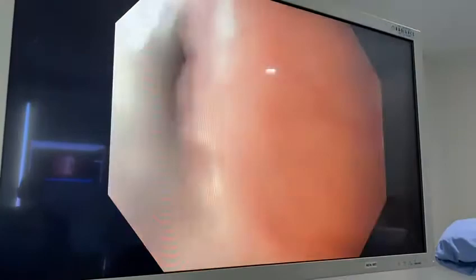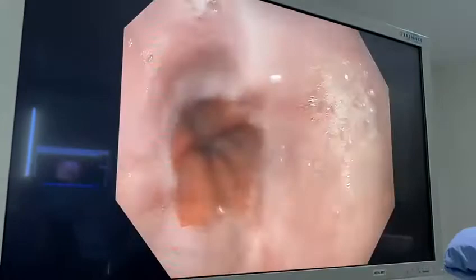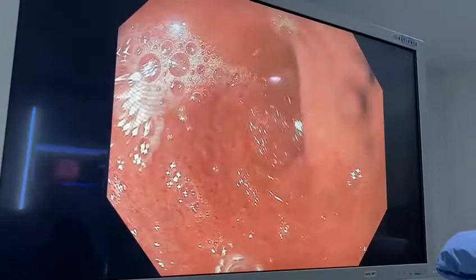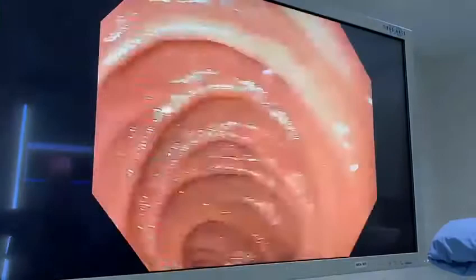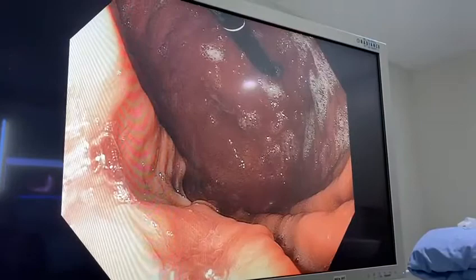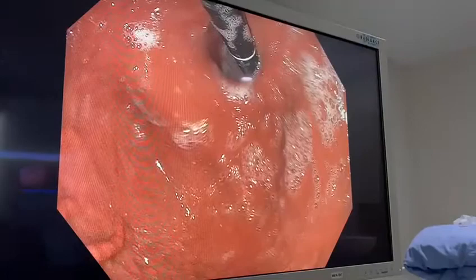First we inspect the stomach to make sure that there are no surprises there. I'm in the stomach now, I'm going to do a quick inspection. This is the first portion of the small intestine, the duodenum. It looks beautiful. The stomach looks good.